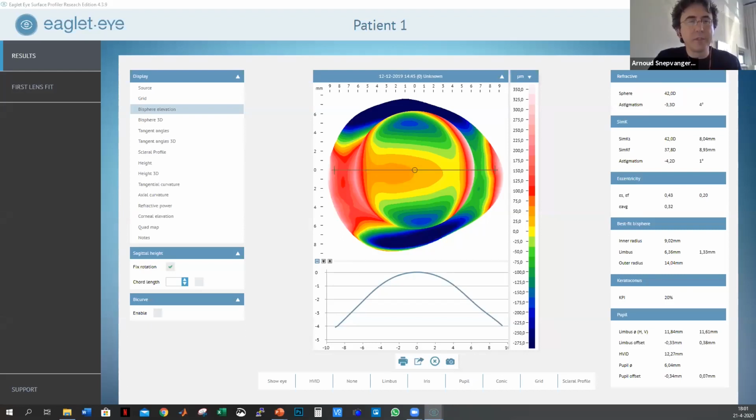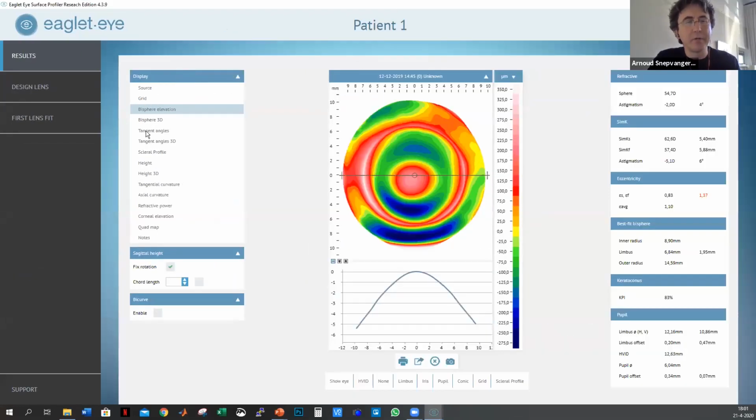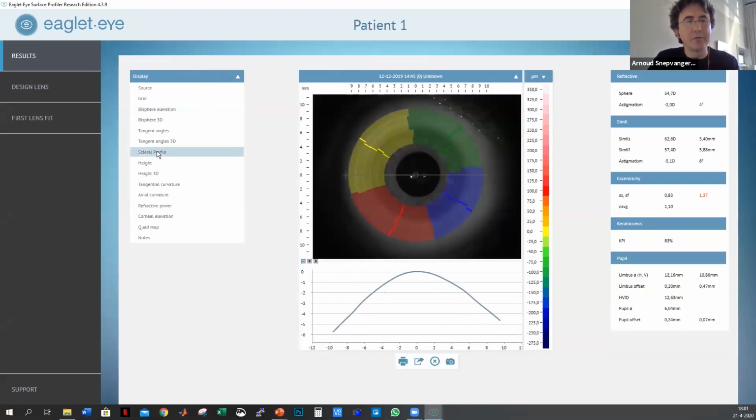Most of the time it is, though not for all of our users. We have some practices where you ask the patient to pull down the lower lid, which most people can do, and then the operator reaches over the device and holds up the upper eyelid. That can be done, but I think two people is usually going to give you the best results. Absolutely.